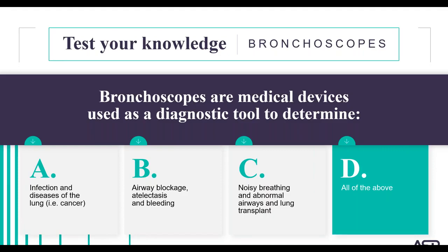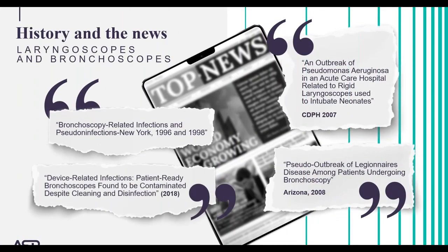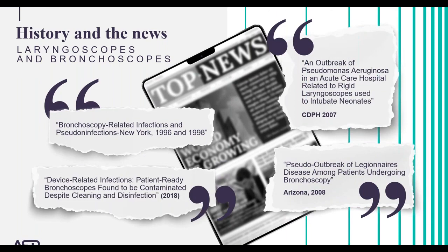So now that we know what laryngoscopes and bronchoscopes are and why they are used, Janet's going to take us through a little bit of history and what variables can contribute to an infection when using these devices. Janet? Thank you, Reggie. Welcome, everyone. Improper reprocessing of these devices in the past has caused news headlines and has influenced current practice for reprocessing these devices. And we'll just take a look at one of these headlines.